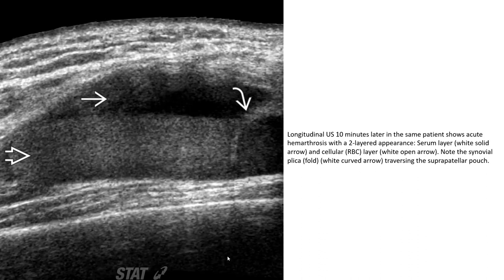This image shows hemarthrosis with a two-layer appearance: the serum layer and the cellular layer, with the synovial plica traversing the supra-patellar recess.